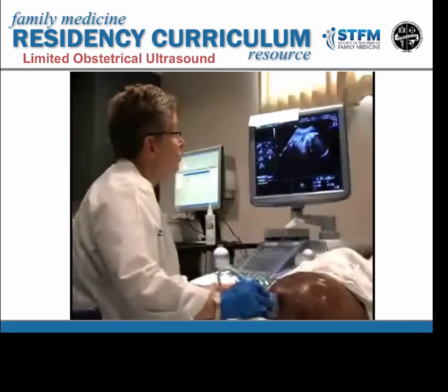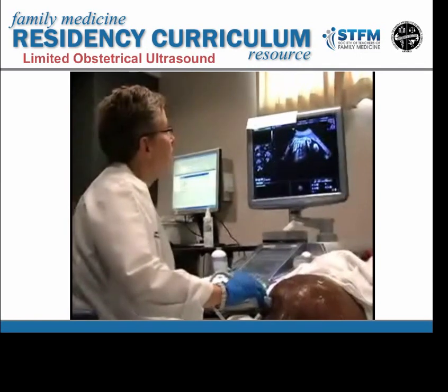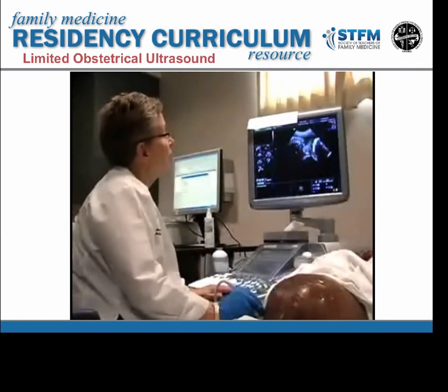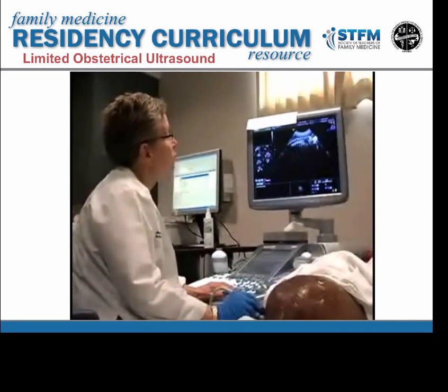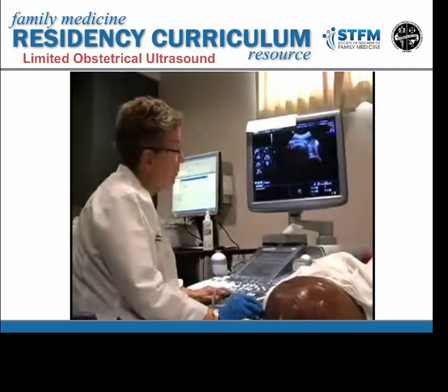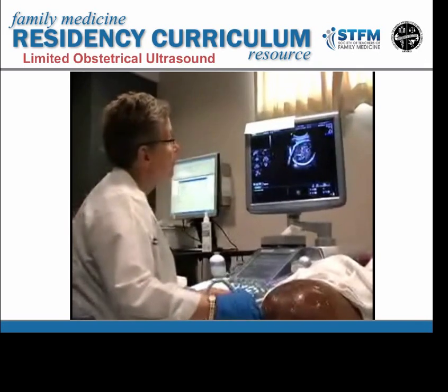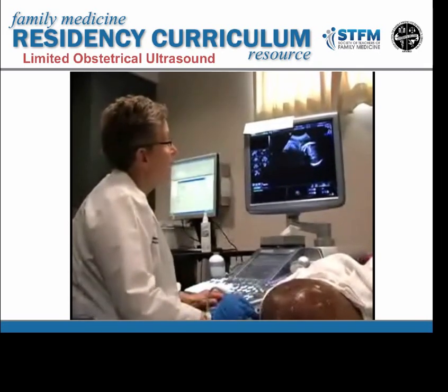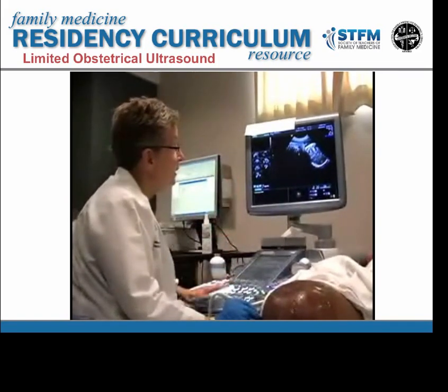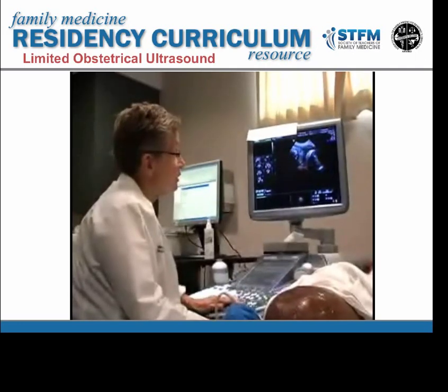To confirm that, I'm going to move my transducer up, and what I see as I come up is that the spine is over here. I'm going to move my transducer laterally until I get a nice sagittal view of the spine, which you can see right here. And while the spine looks sagittal, you can see my transducer is also going up and down. So the finding of a head coming over the pubic bone and a spine that is in sagittal view with the transducer going directly up and down in the mother's uterus confirms the finding of a vertex presentation or a cephalic presentation.